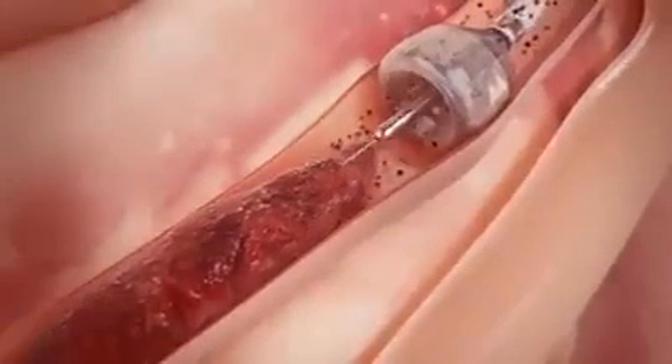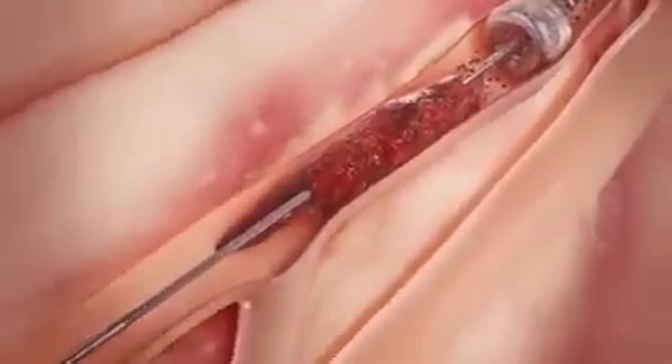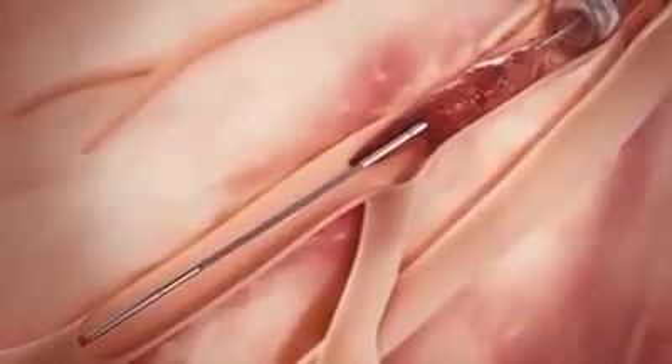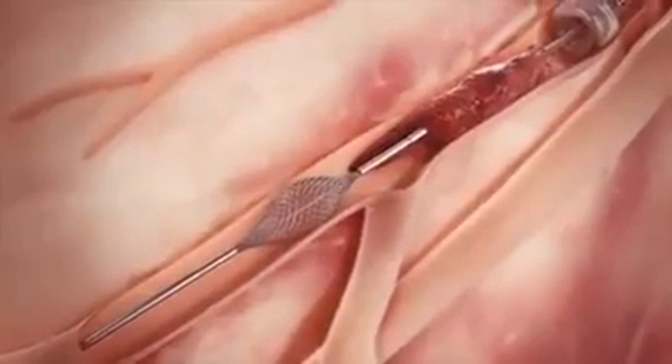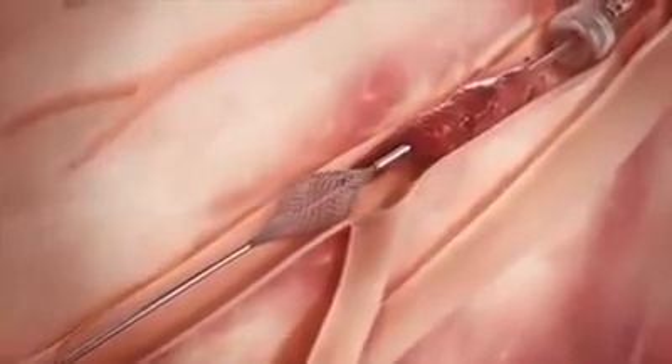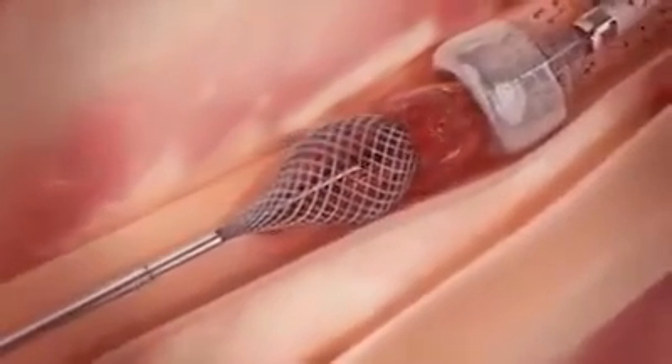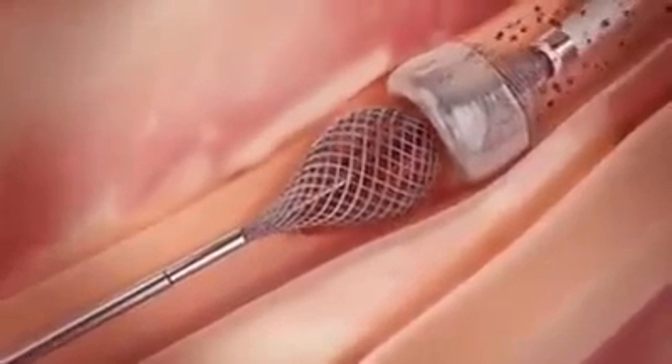Once the Megavac arrests blood flow, the thrombo wire is inserted through the catheter, advanced through the clot, and deployed distal to the clot. While applying suction with the Megavac, the thrombo wire is retracted to simultaneously pull the clot into the funnel mouth and through the catheter.